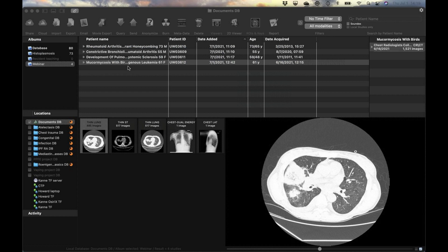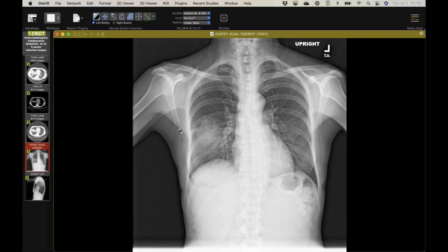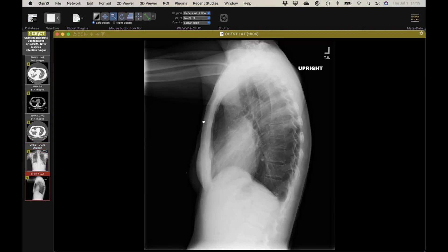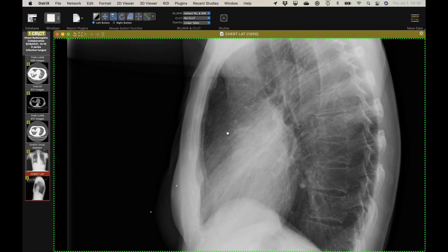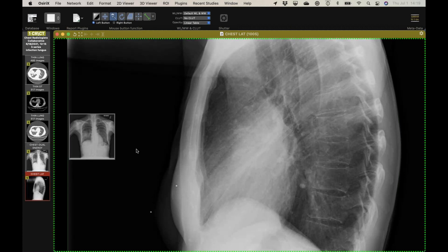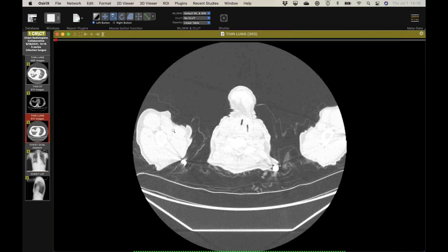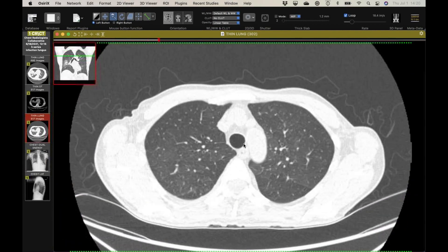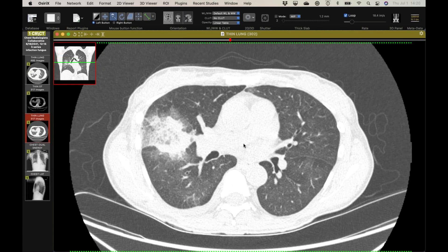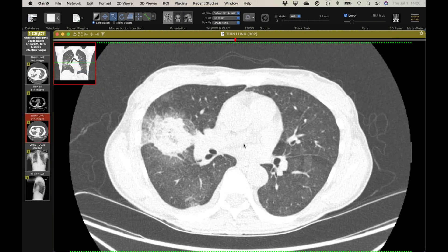I have three related cases and one nice example of something unrelated. This is a middle-aged woman who has refractory acute myelogenous leukemia. She had had a previous acute lung injury that had resolved, but on this follow-up imaging this big mass appeared and wasn't there two weeks ago — it's got very ill-defined, fuzzy margins. On the lateral view we can see it anteriorly. When I see a big mass in someone who's neutropenic, I worry about bad bugs, fungus in particular, and when really big I think about mucor. So they did a CT scan. We have a very nice example of a bird's nest sign, which we've shown lots of examples of but it's still not well known.